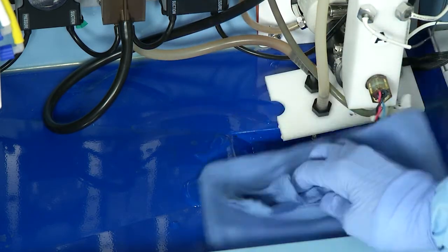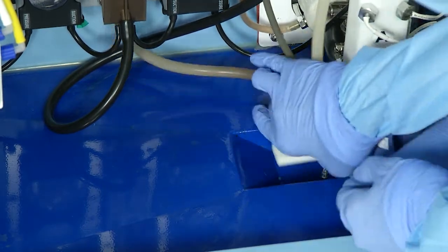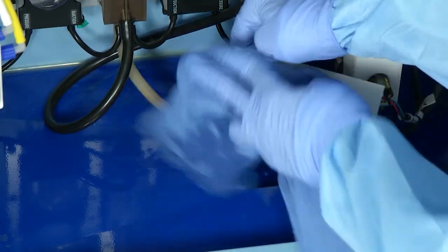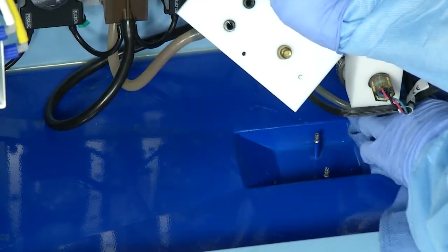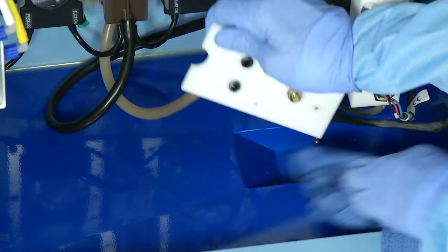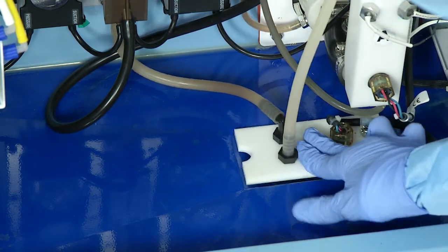Next, wipe out the drip tray with a dry cloth and clean the sensor on the bottom of the plate. Finally, press the plate back into place.